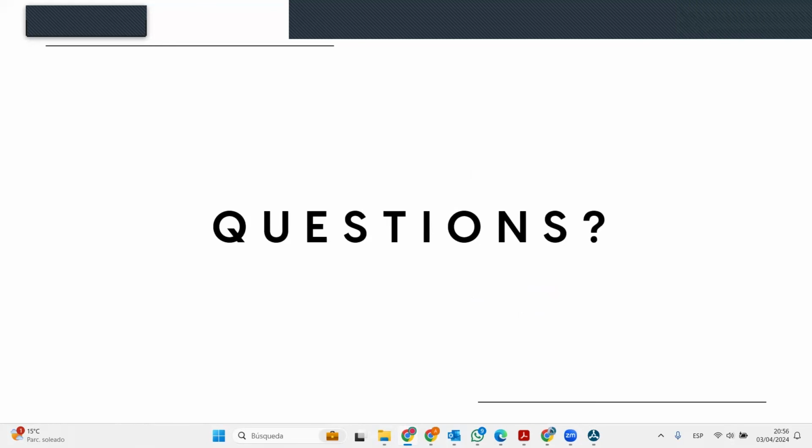And we have one last question that I'm going to launch for you. Hold on just one second. Having a little technical difficulties here.